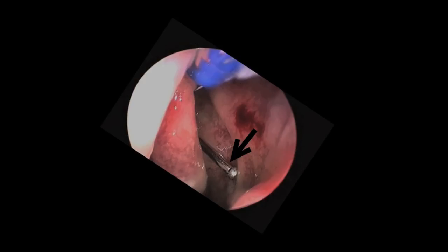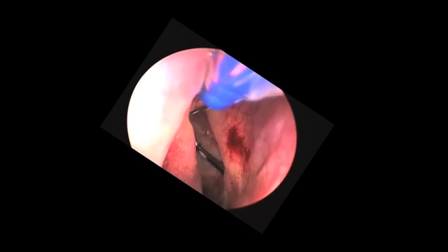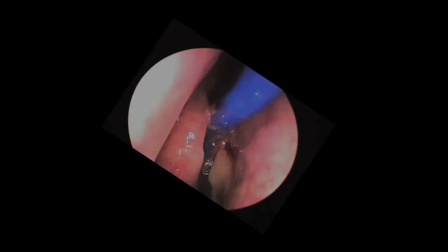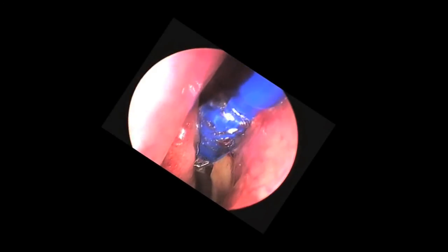This is the balloon itself and the tip of the device that guides the balloon into the sinuses. Here, the tip of the device is being inserted into the maxillary sinus. The balloon is being advanced, then dilated, and then removed.